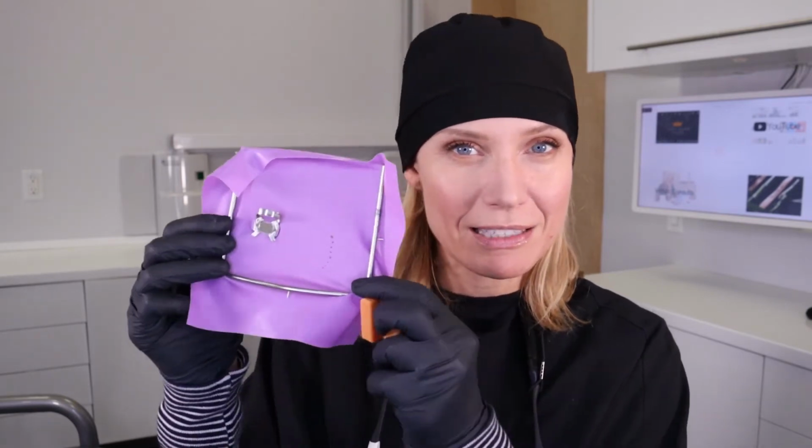So just so I can back up for a second, the rubber dam is this piece of rubber. It's a non-latex rubber. The holes are punched to accommodate exactly where we're working, and then there's a little ring right here that squeezes around the back tooth, and it'll feel like some pressure, but it just does that to help hold everything on. And then we poke your teeth through these little holes you see here, okay?